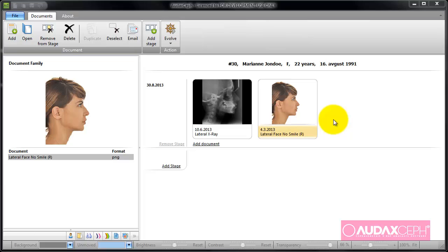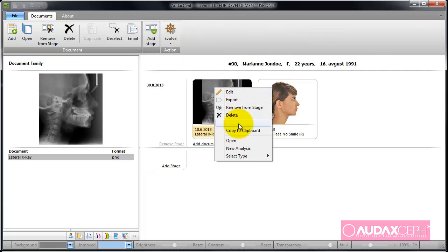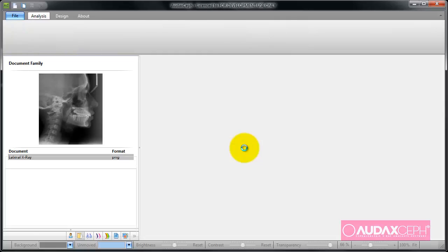To create an analysis, I choose lateral x-ray and one of two options: either evolve, or from the third mouse button, new analysis.